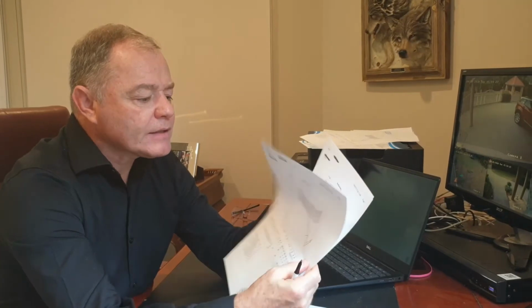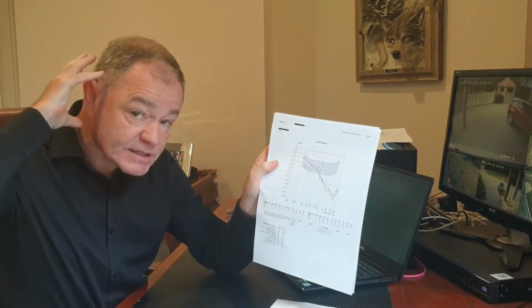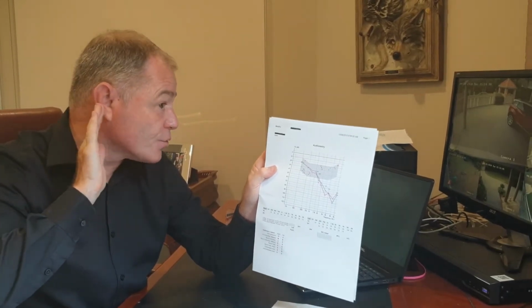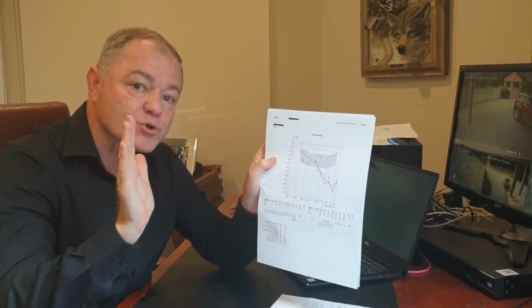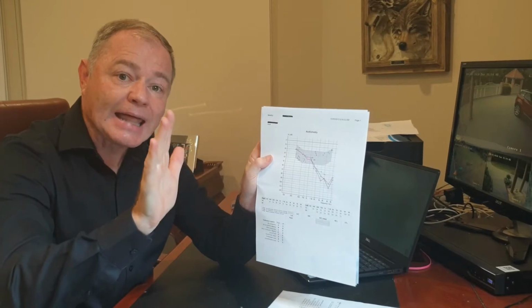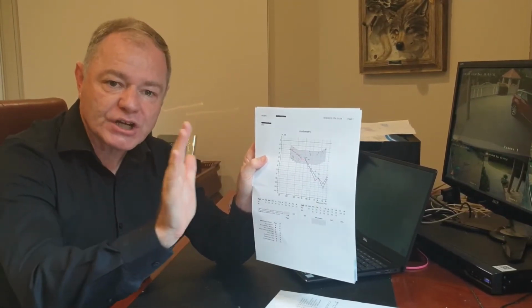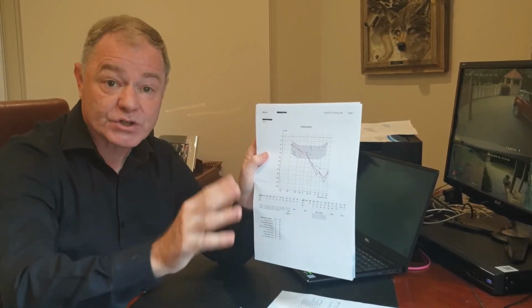Now, the other thing I just wanted to point out was we do typically 2 hearing tests when we test your hearing. So the first test is with the set of headphones, and in that case the sound travels down through your ear canal, it strikes the eardrum, and then it goes through the middle ear where you've got the ossicles, the 3 little bones in the middle ear, and then the sound vibrates, the last bone in the chain vibrates against an inner eardrum into the inner ear, which is the cochlea.